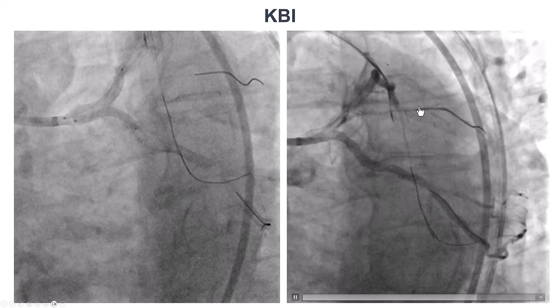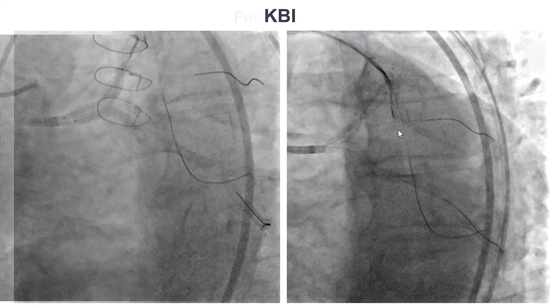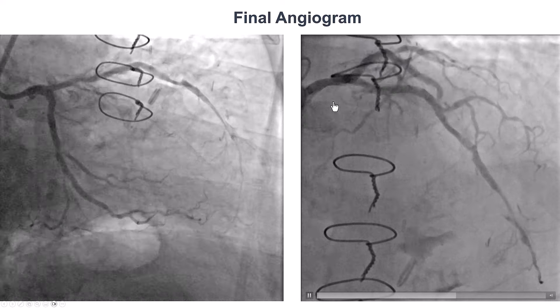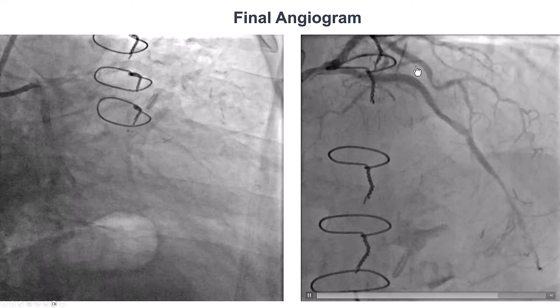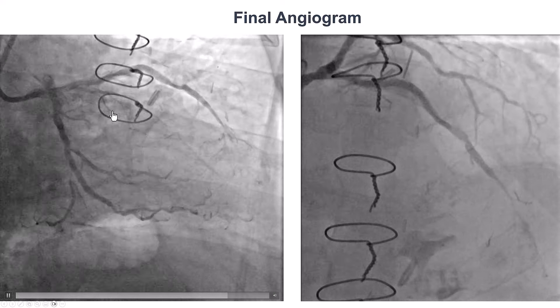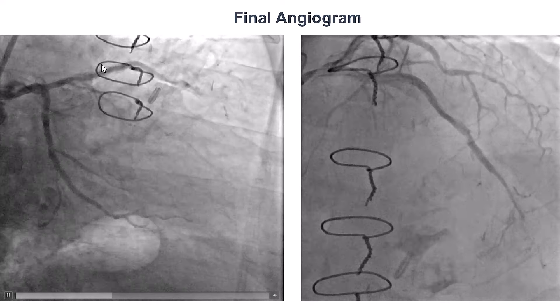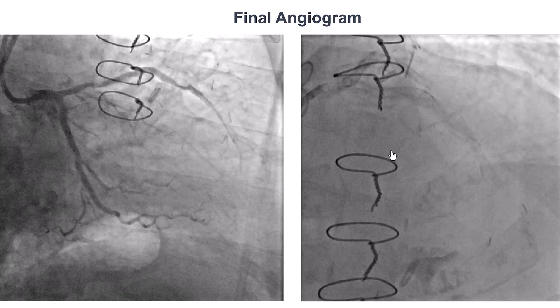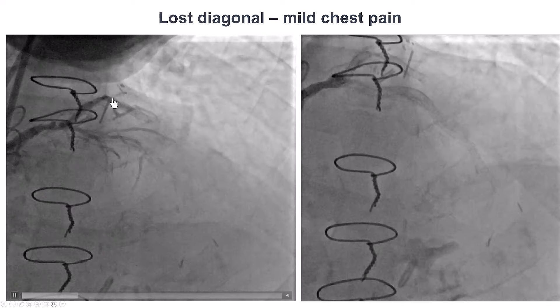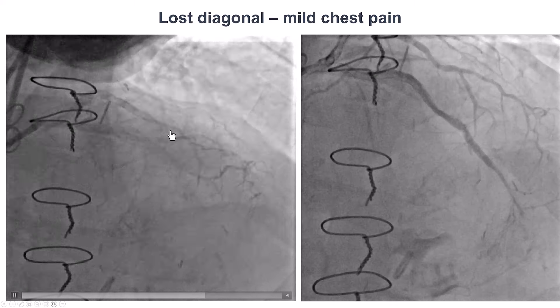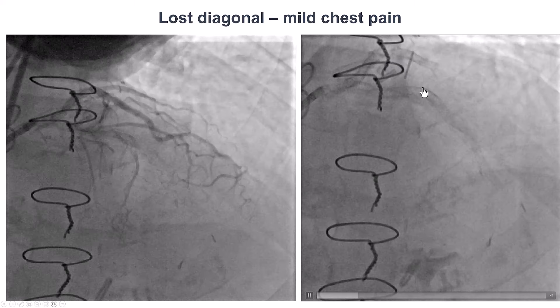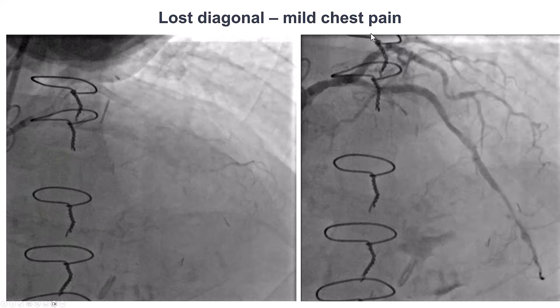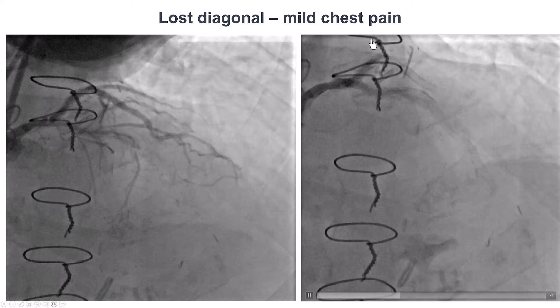We advanced a guidewire into the diagonal branch, which was preserved, and achieved a nice final result with TIMI 3 flow into the LAD. However, we did lose the small diagonal branch that was present at the beginning. It was present before and missing afterwards, likely causing the patient's mild chest discomfort and mild EKG changes. But he did pretty well overall.